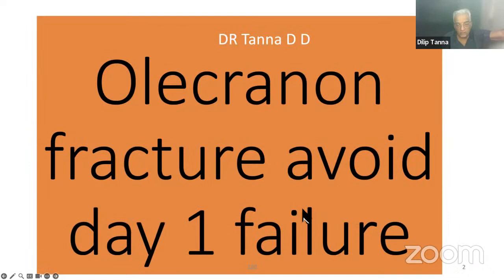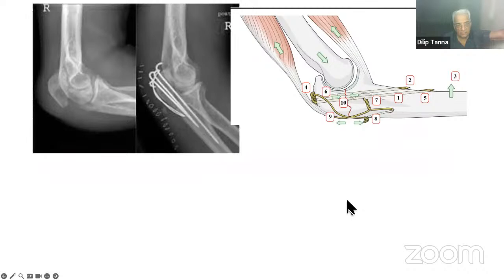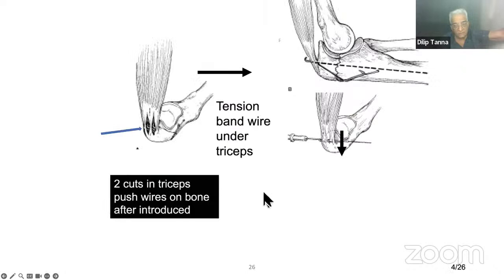Olecranon fractures, avoid day one failure. See, this is a standard treatment which we give for olecranon, where the wires go intramedullary. If it goes, this has a tendency to come out. And conventionally, the cerclage wire is looped around the K wire. But what is recommended is this: the cerclage wire should be inside the K wire, onto the bone, rather than looped around the K wires. So this is what has been recommended.